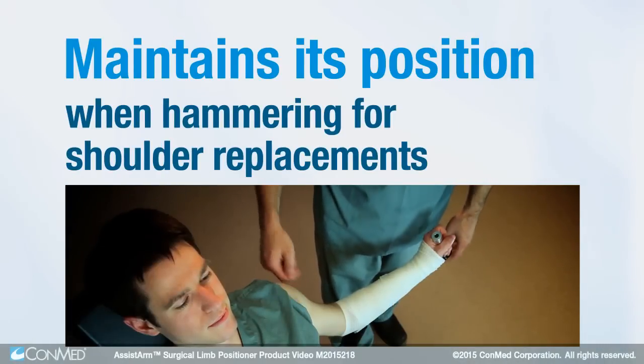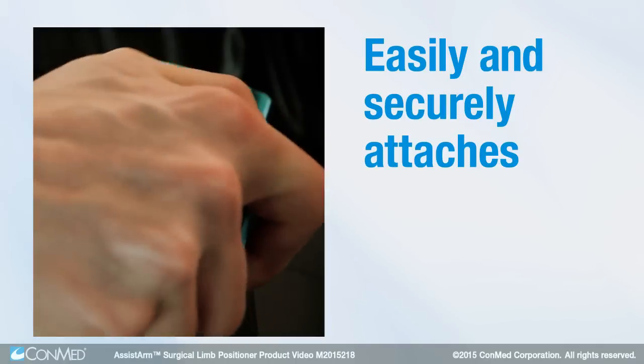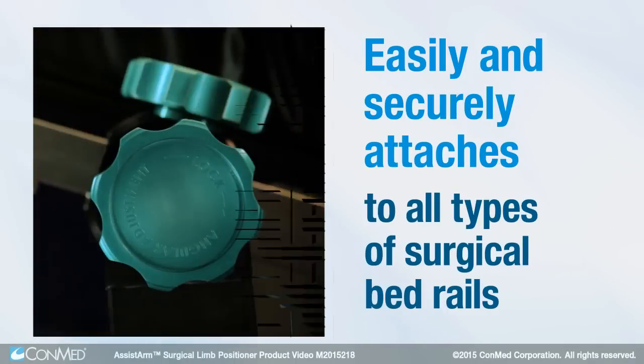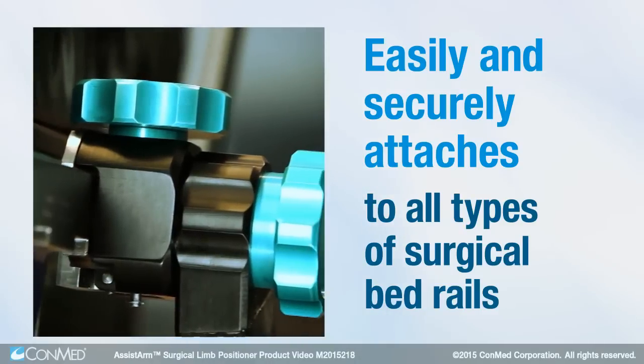and maintains its position when hammering for shoulder replacements. Optimized to minimize setup time, the Assist Arm easily and securely attaches to all types of surgical bed rails with no need for additional adapters, wires, or batteries.